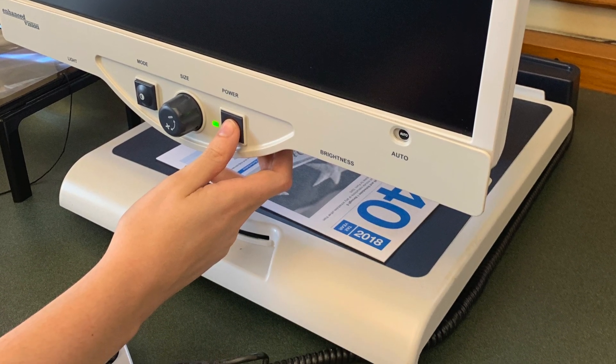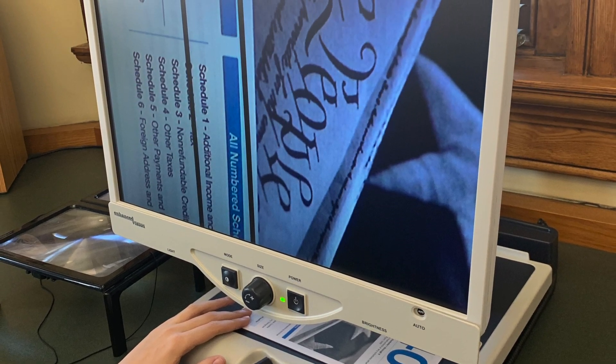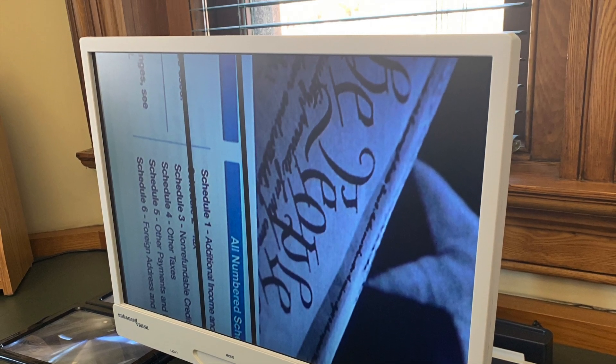To begin using the system, press the power on button. Once the machine is powered on, you can place whatever material you need magnified on the movable tray directly below the screen.